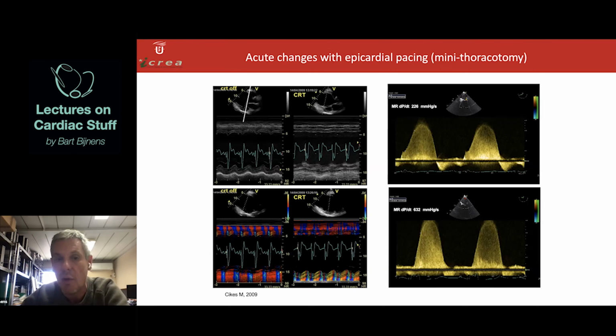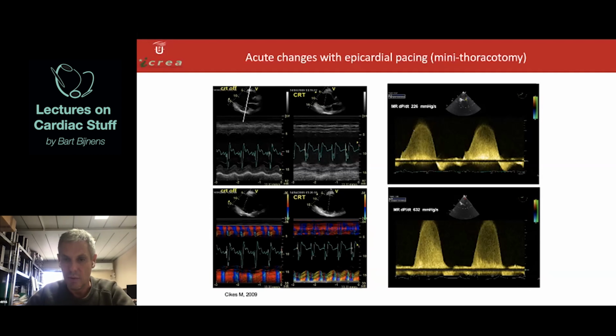And here, this is after therapy, in this case cardiac resynchronization therapy. We come back to that later on, what it does, but what you can clearly see is that in this Doppler, the slope becomes much, much higher. So you see that the derivative of this pressure becomes higher. And so you know that the contractility of this heart is actually more important.